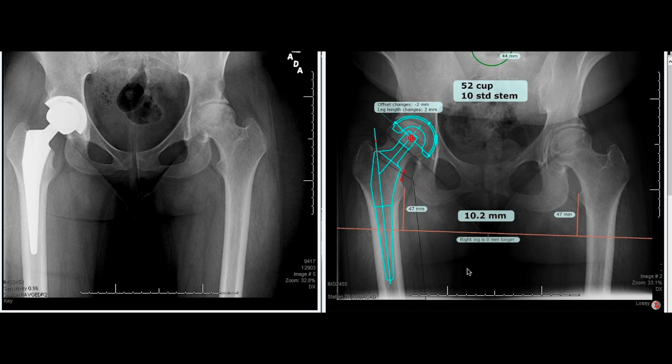Next, I'm going to compare the preoperative template radiograph to the postoperative result to show how templating helped us get to the final product. Looking at our radiographs in comparison, here are the final implants that were placed. The patient ended up getting a 52 cup and a 9 standard stem instead of a 10 standard stem. This is the stem that we had intraoperatively that showed good fit, and you can see postoperatively that a size 9 had very nice fit in the canal as well.